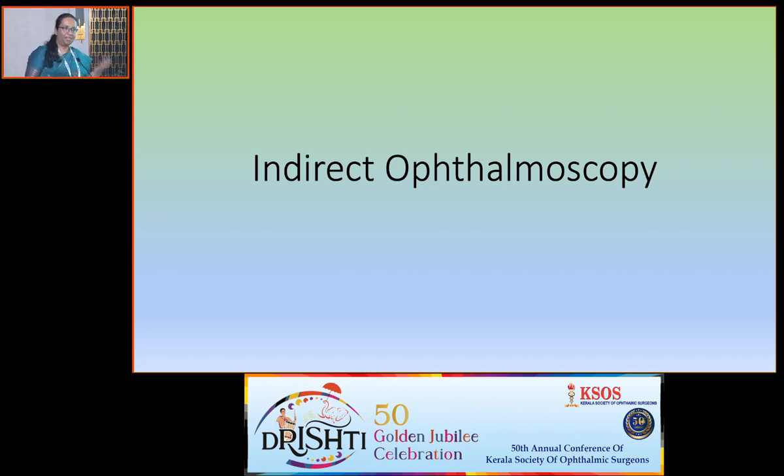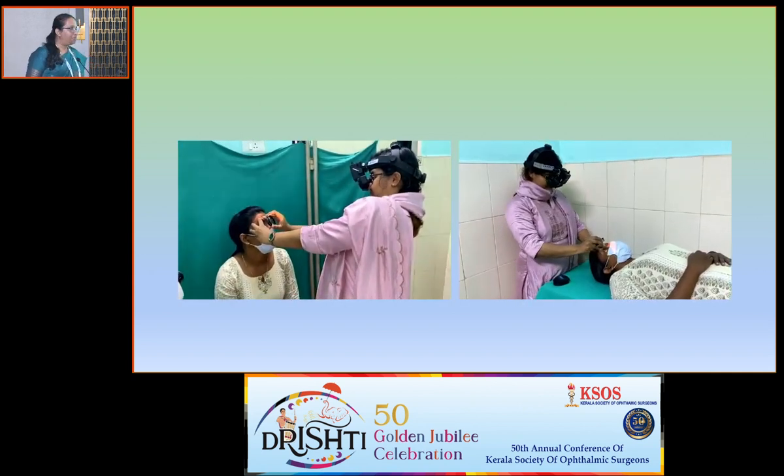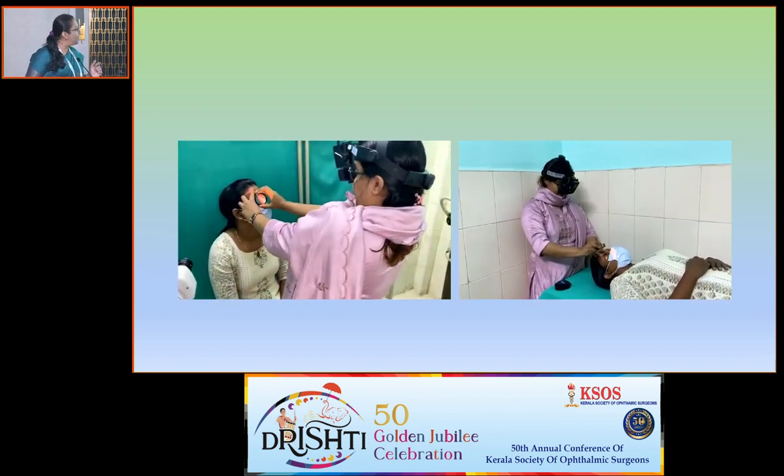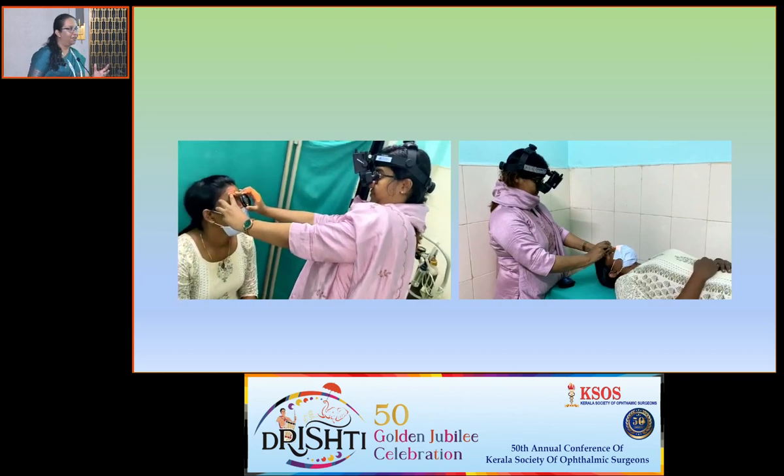That care shown to the patient might not be care for your spine. Now, coming to indirect ophthalmoscopy, a standing position will give you a hyperextension of the wrist. Then your back is going to be awkward. You have lateral turning of the spine. Don't do it. Make the patient lie down, and the examination should be done there.